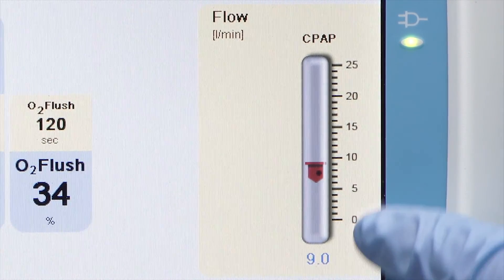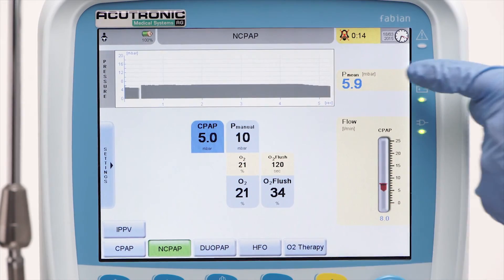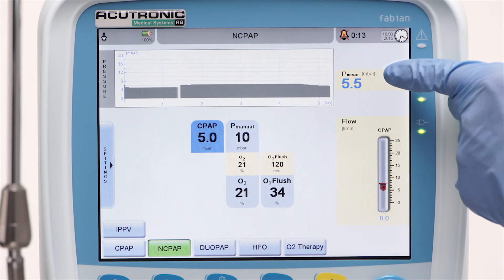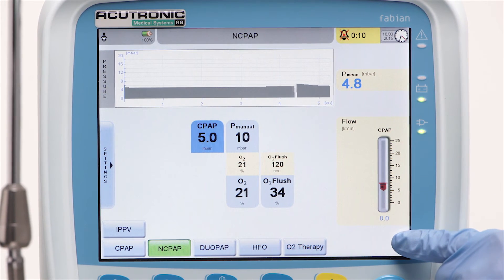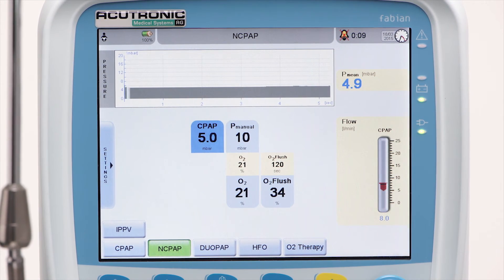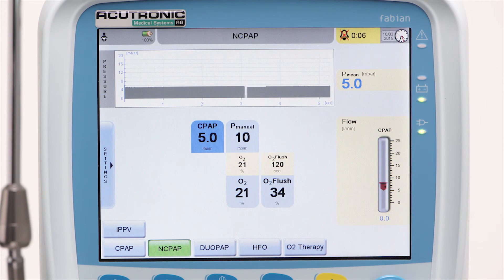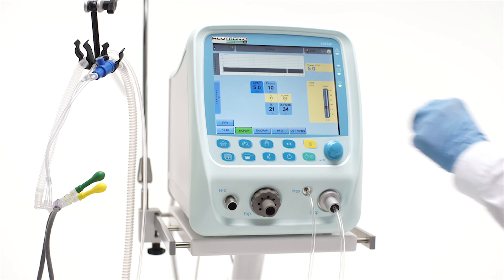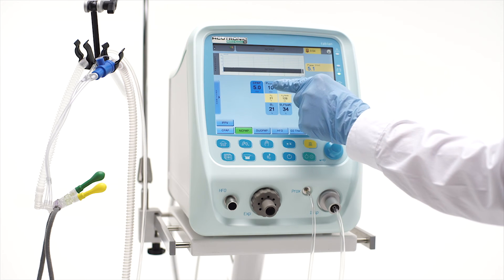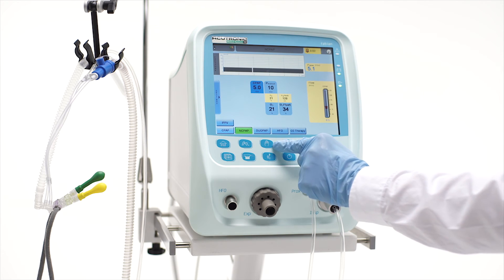The CPAP level is dependent on the flow rate inside the generator chamber. To maintain a stable CPAP level in this mode, the Fabian has an automatic leak compensation which may increase the flow rate to a maximum of 40% of the initial flow used for the preset pressure level.